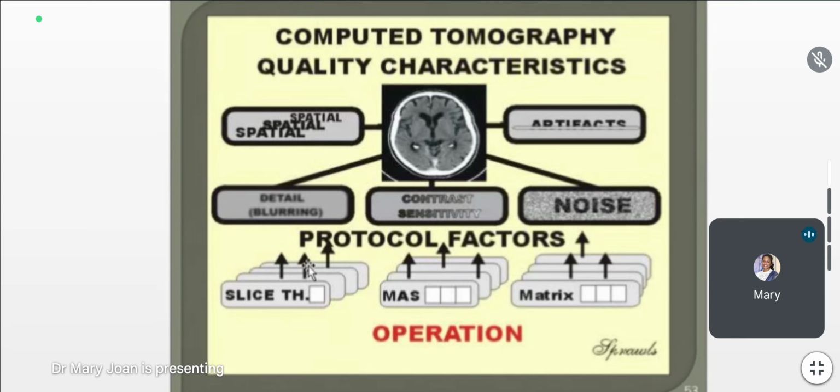If there is more information and more signals causing blurring, then contrast and sensitivity, how well the bright area and the dark area can be identified and appreciated, and how good the system is in identifying a deficiency or defect in the system.